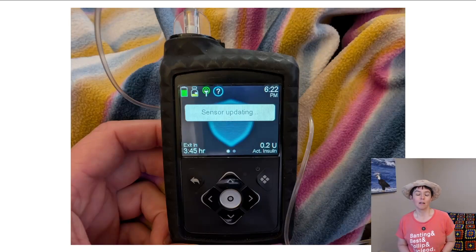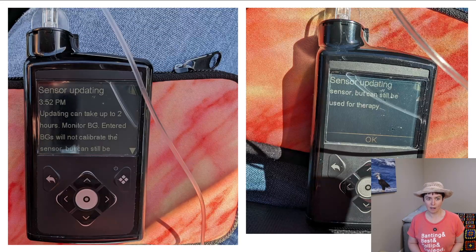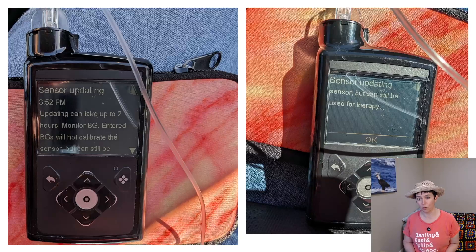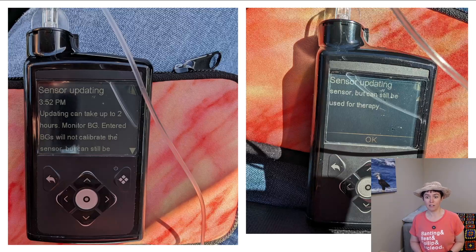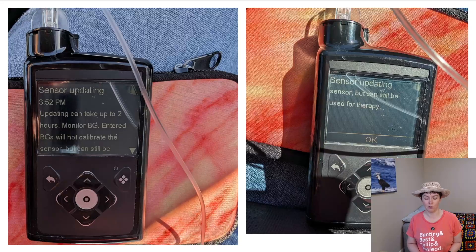On the first day, sometimes you get a 'sensor updating' message, which is really annoying. You can get it any day, but on the first day it's more likely. You can go through the two-hour warm-up for the Guardian 4 and then go into sensor updating for several more hours — potentially half a day without any CGM reading, which makes managing your blood sugar more challenging. The message reads: 'Sensor updating. Updating can take up to two hours. Monitor BG.' Make sure you always have a working blood glucose meter with non-expired strips. Because this pump doesn't require calibration, it's easy to let your test strips expire, so always replenish them. A blood glucose meter is probably the most critical backup you can have.